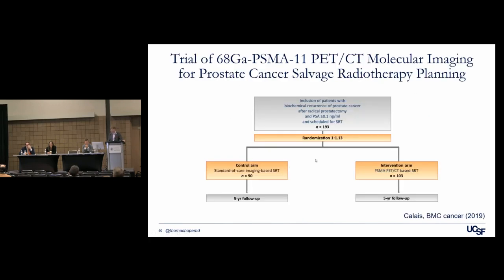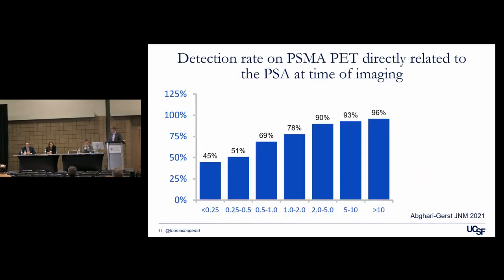So this is done enrolling. Jeremy is running a trial here of PSMA PET, with patients randomized to get PSMA PET versus conventional imaging, and this will hopefully read out like EMPIRE-1, showing that patients will have improved biochemical-free survival when you plan your radiation therapy with PSMA PET.